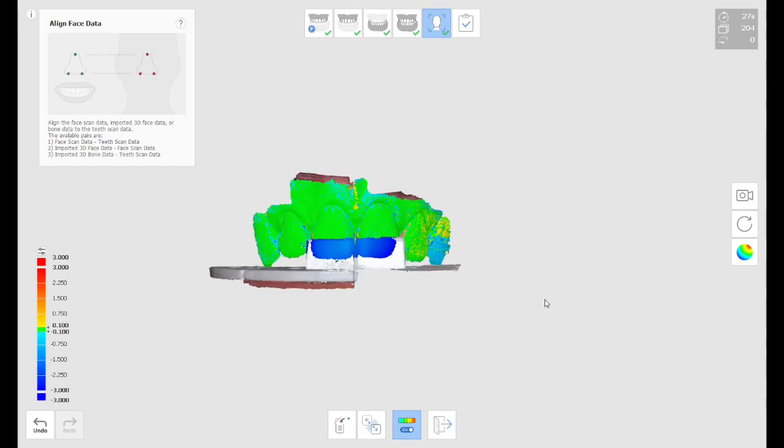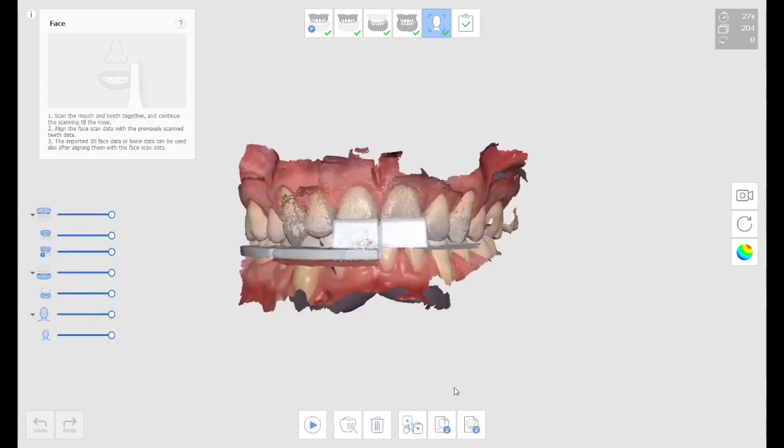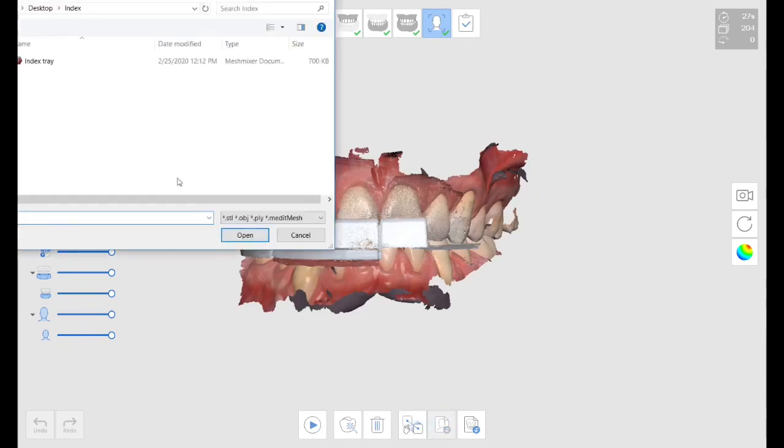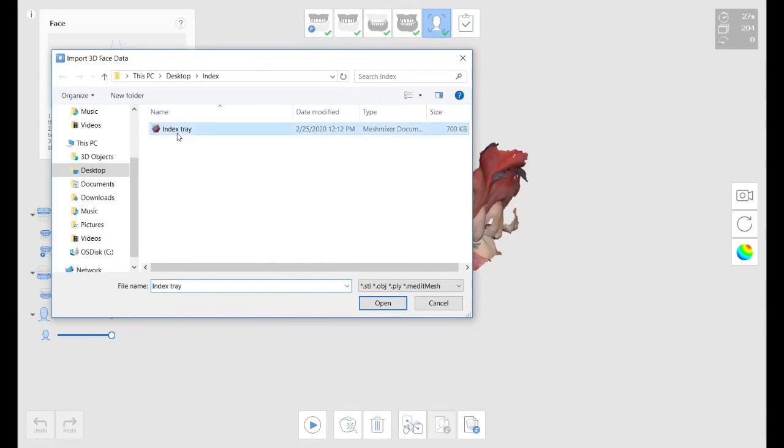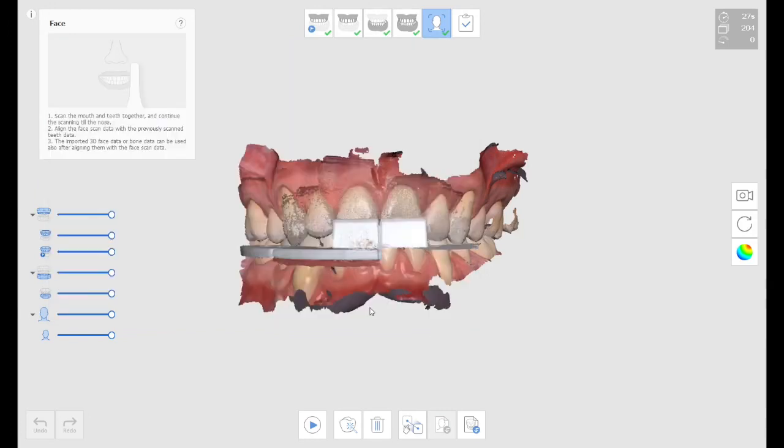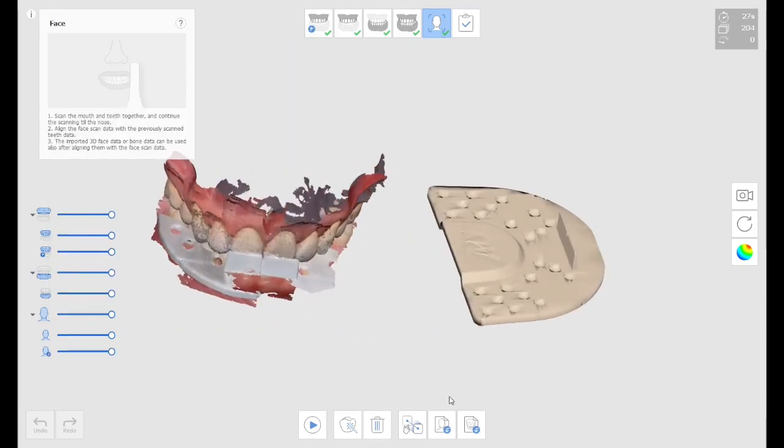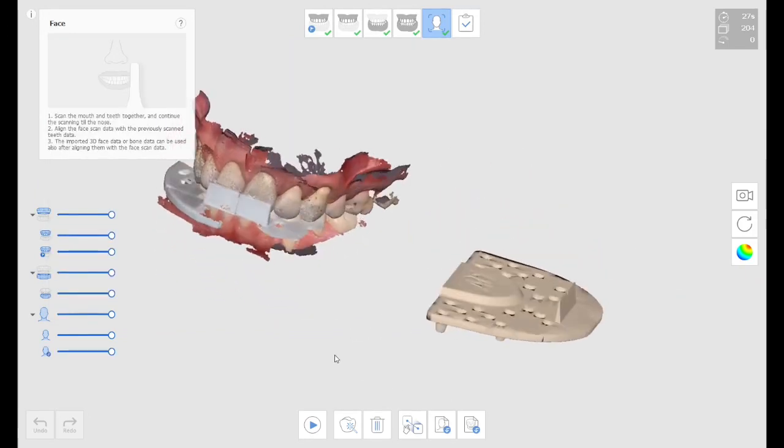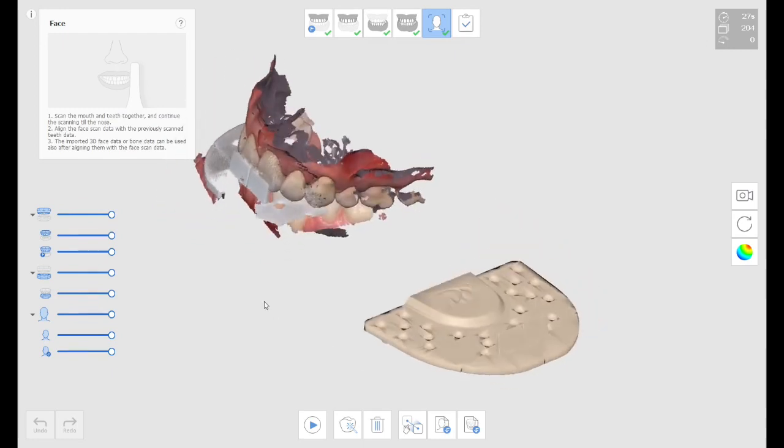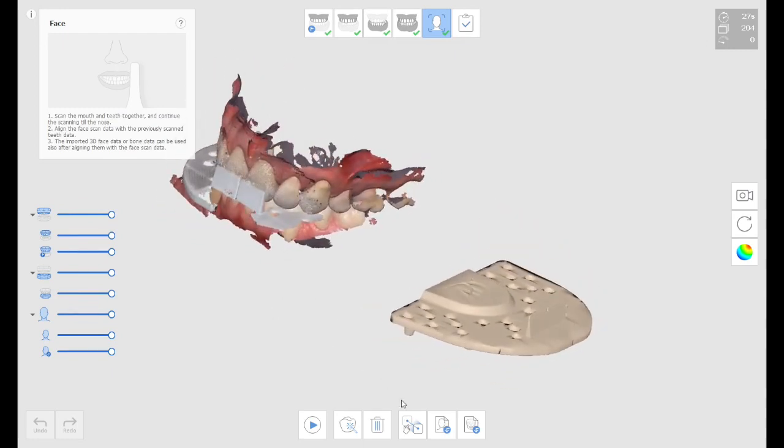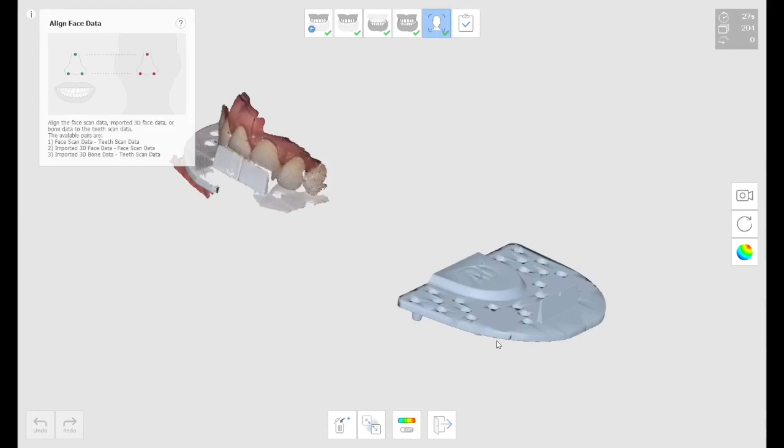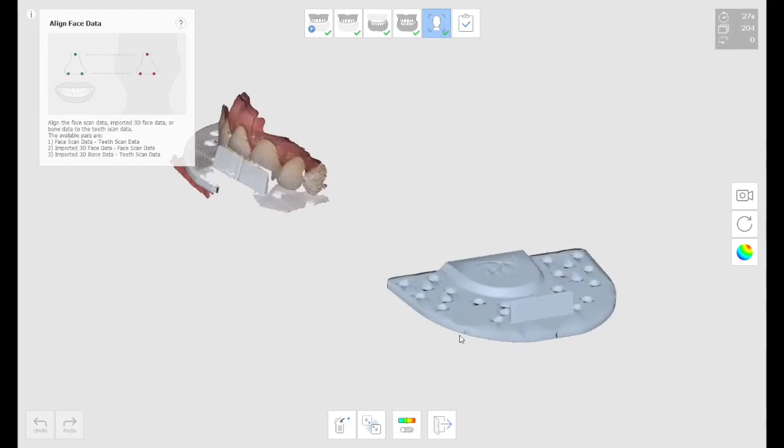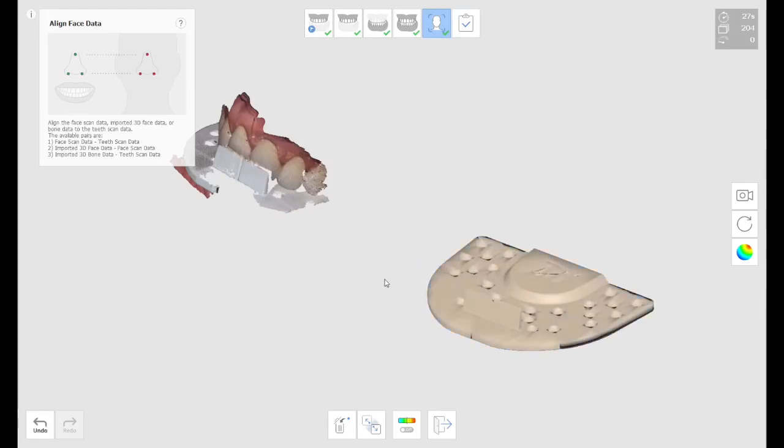Now, most of the times, the problem is I don't have a file, a complete file of that index tray to position the models in the virtual articulator. With this new functionality, I can go ahead and import the STL file slash face scan, which is not a true face scan. In this case, I'm hacking the technique. And then I'm going to choose that I want to scan the index tray to the face scan.